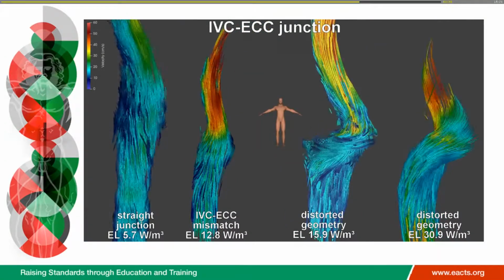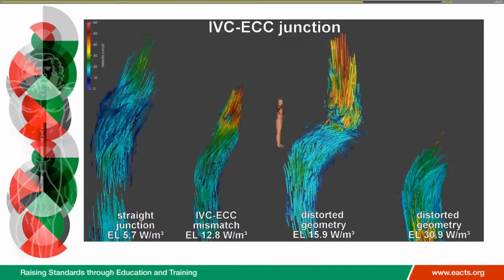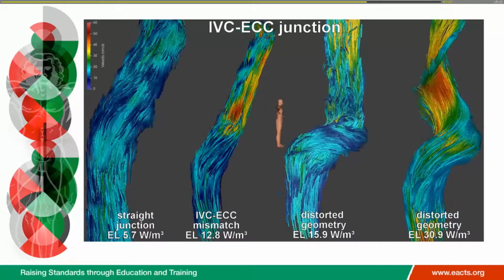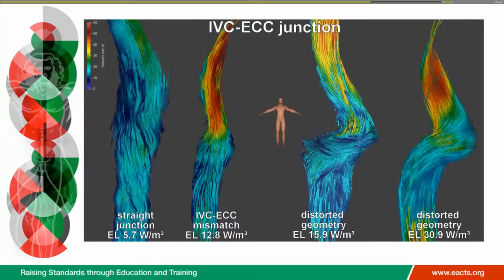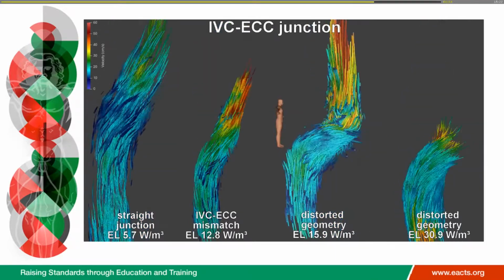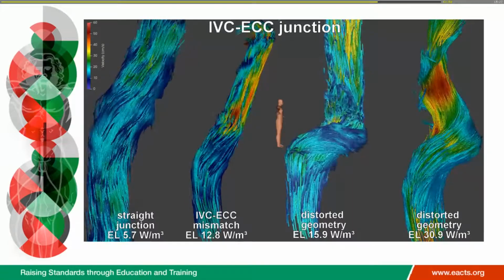Did you look at pleural effusion drainage, PLE incidence? You say they're asymptomatic, but you may have a surrogate marker of patients who are not doing as well. No, I actually didn't look at it, so I'm not sure. But the current work of our group is to look with this 4D-flow MRI technique at the whole TCPC.